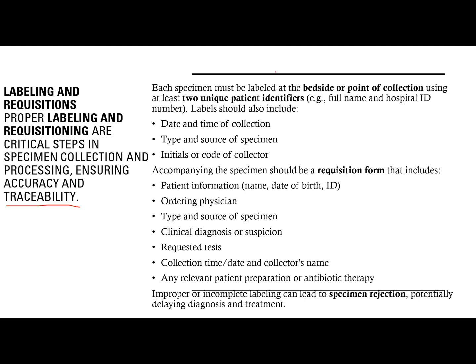Yung doktor ba? So you need to make sure that every time you have your specimen collected, it has to be labeled at the bedside or point of collection. Bakit bedside? You have to label it bedside, class, because you want to validate the identity of your patient. So kung katabi mo yung pasyente, meron yung name tag. Itanong mo yung pasyente, kayo po ba to? Ano pong pangalan nyo? Ipa-identify nyo yung hospital ID number, check for label sa pasyente.